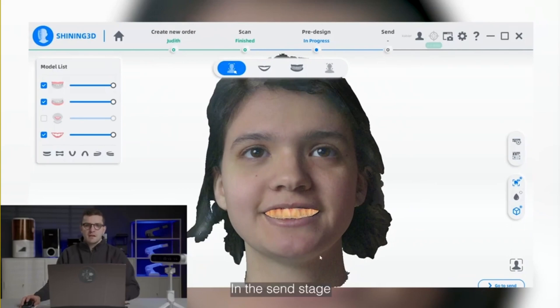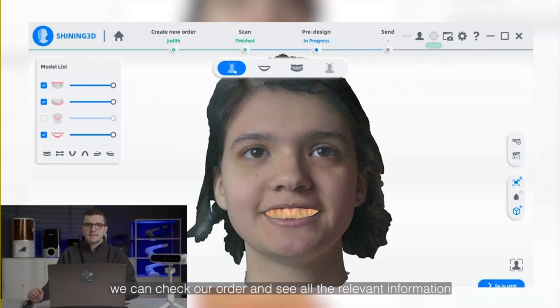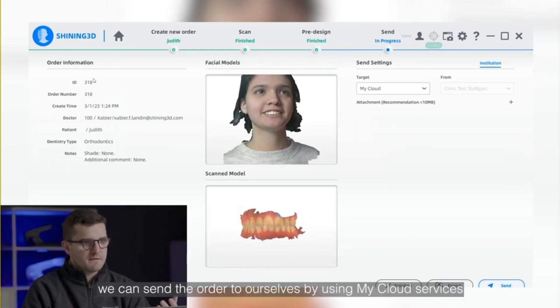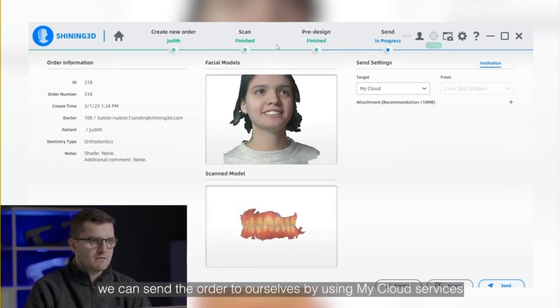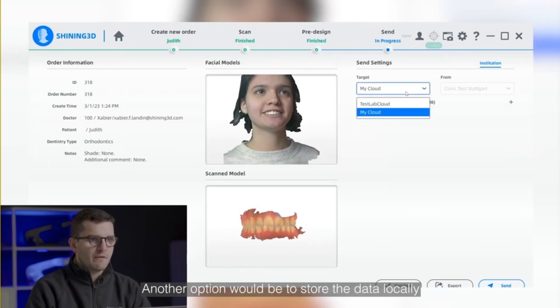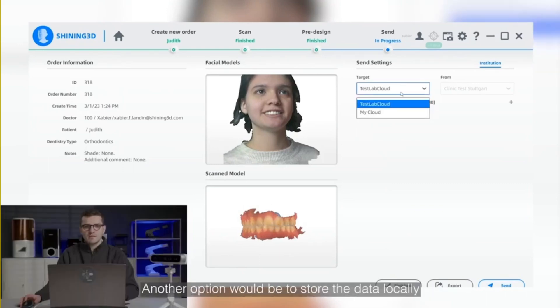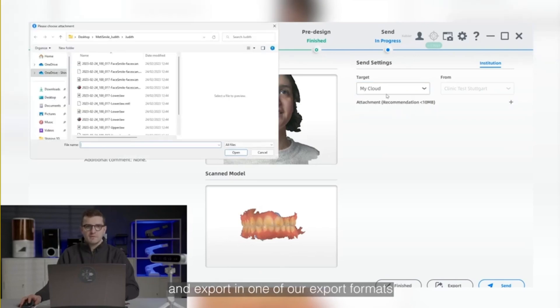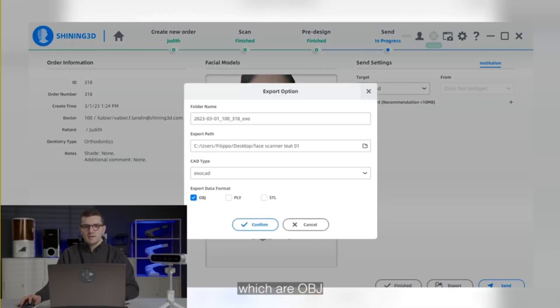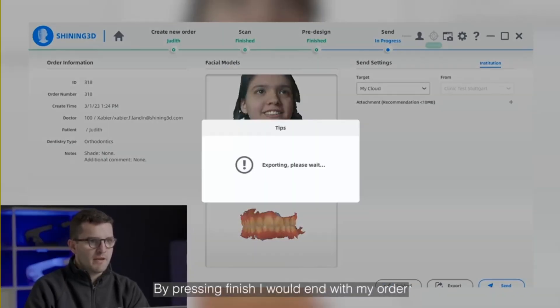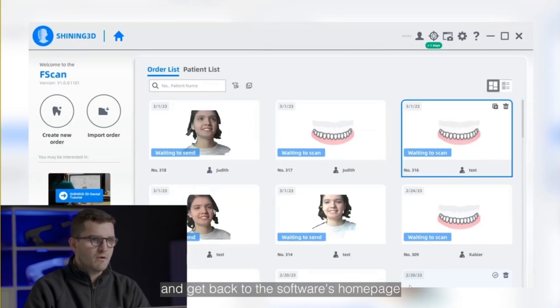In the send stage, we can check our order and see all the relevant information. We can send the order to ourselves using cloud services or send it to one of our connections. Another option is to store the data locally and export in one of our multiple export formats, which are OBJ, PLY, and STL. By pressing finish, I end up with my order and get back to the software's home page.